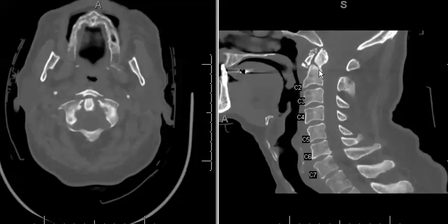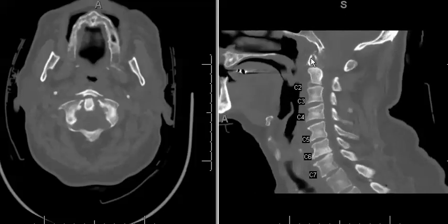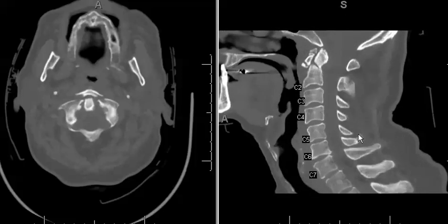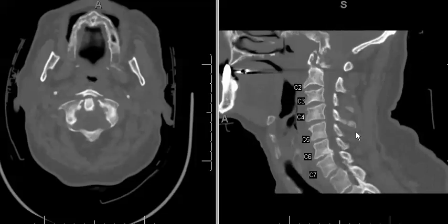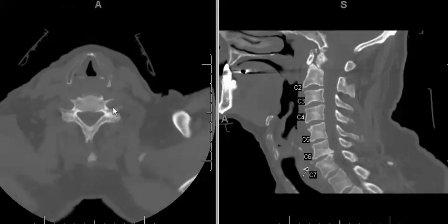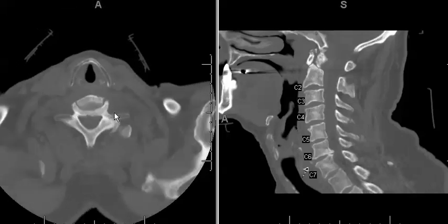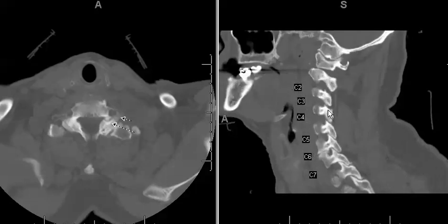We have a type 2 odontoid fracture. We have a two-part C1 Jefferson Burst Fracture. We have a fracture through the spinous process of C4, and finally a fracture through the left C7 pedicle and transverse process. These were the fractures identified on this trauma scan.